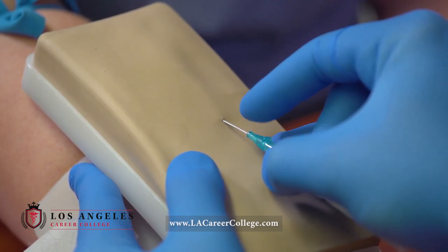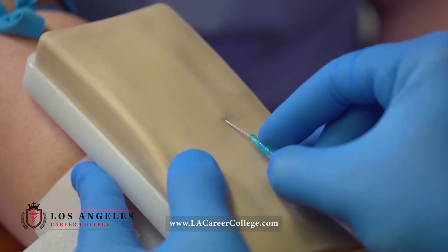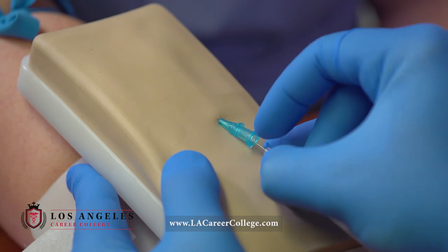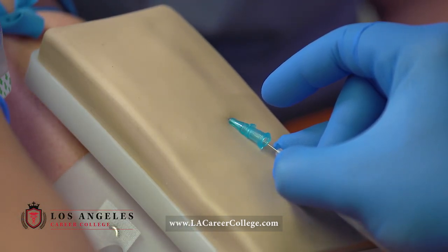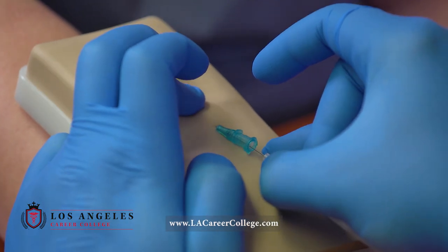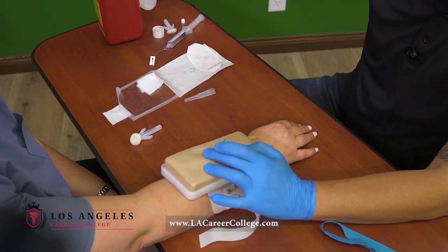I'm going to go ahead and go in. When you're going in, you're going to feel resistance, resistance, and then you're going to feel no resistance. When you are inside of the vein, you will see blood return right over here, and also inside the catheter. If you do see blood return, stop, lower the angle, advance just a little bit more, and hold your needle in place as you advance your catheter. Keeping your needle in place, let go of your non-dominant hand and release your tourniquet. I will go ahead and apply pressure. As you take out your needle, press the white button to retract the needle, and immediately it goes into the sharps container.